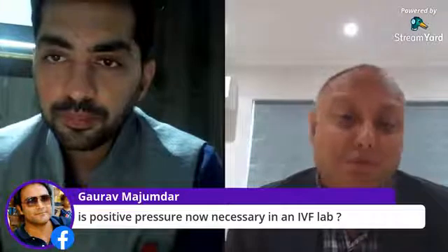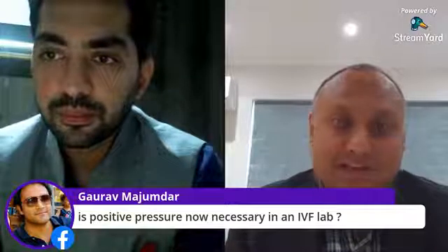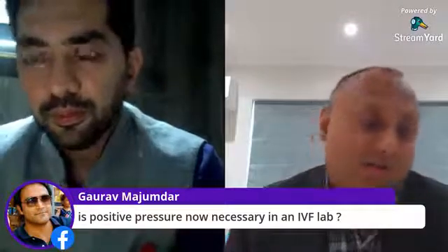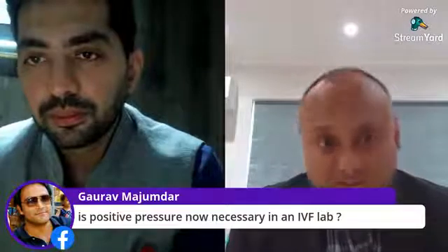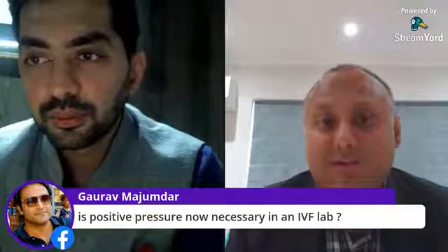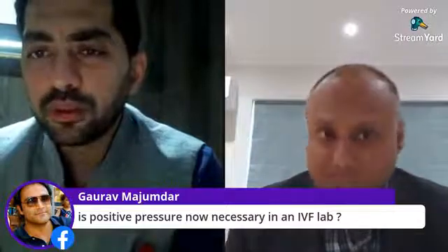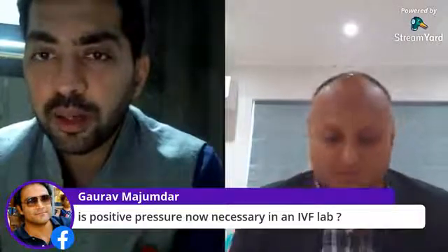Now, for labs that do not have positive pressure, I think their aseptic techniques matter, and for whatever filtration they have in the lab, whether it's Coda towers, etc., if that's what they have, then they need to make sure that they are changing those filters. But if they don't have positive pressure, then in my opinion, it makes them a bit more vulnerable in the whole equation. What about UV?